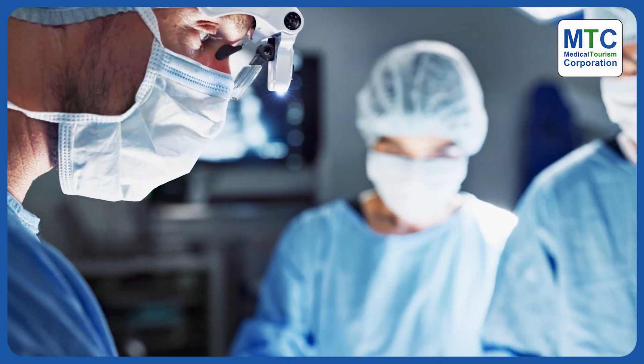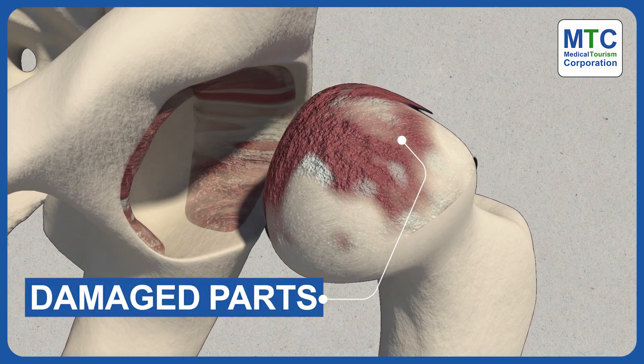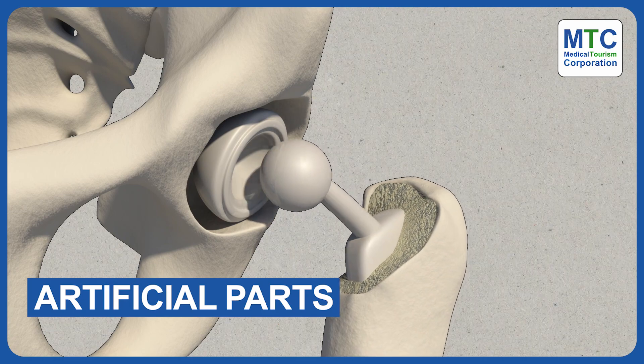During hip replacement surgery, the surgeon replaces damaged or diseased parts of the hip joint with artificial ones. Here's how it's done.